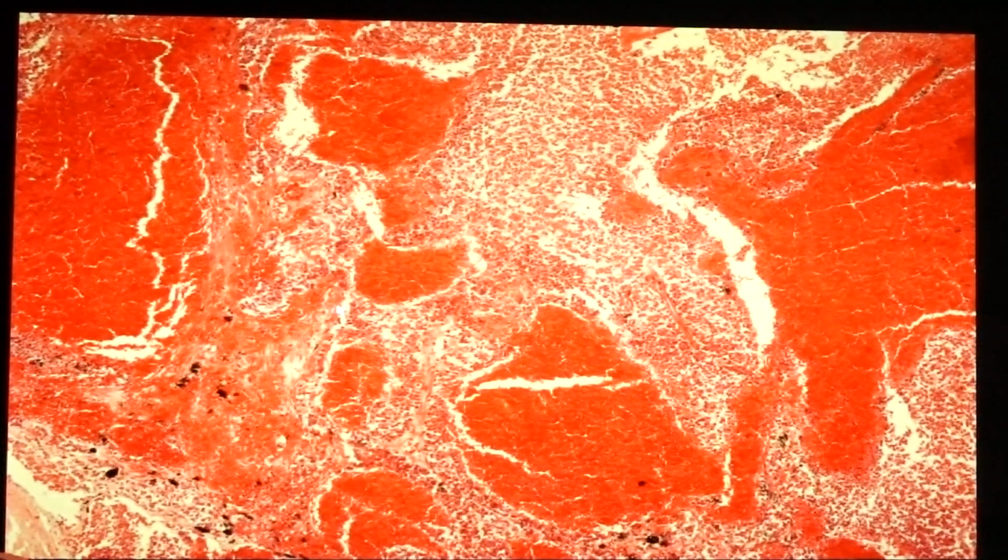Okay, so this is small cell carcinoma. Most of the areas would show poorly stained quality. So we have to look at an area that would show very good quality. I think this would be the area. Okay, this one. Okay, so small cell carcinoma, this is a variant of lung cancer that is highly aggressive. It has a strong relationship with smoking.